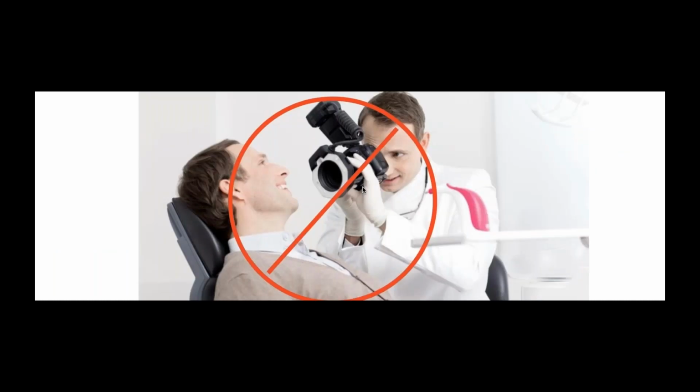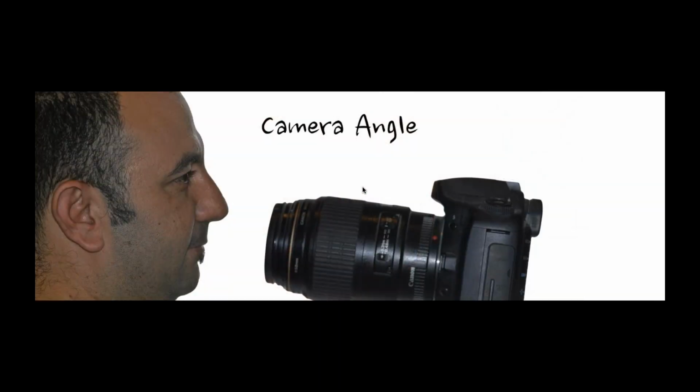Okay, another pet peeve, or what I would say is kind of a challenge and mistake that I see with a lot of the dentistry today, is trying to take photographs of the patients while they're sitting in dental chairs. Do not do that. Even if you see patients in your offices, or if you're teaching your doctors to take the photographs, the patient must be out of the dental chair. And I don't just mean sitting up in the dental chair, I mean out of the dental chair. They should be against the wall, either sitting or standing, depending on the height that you're comfortable with.